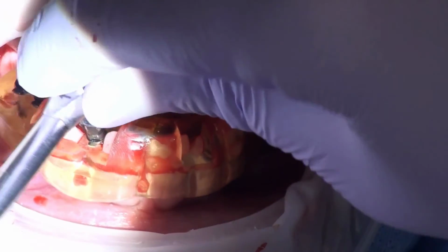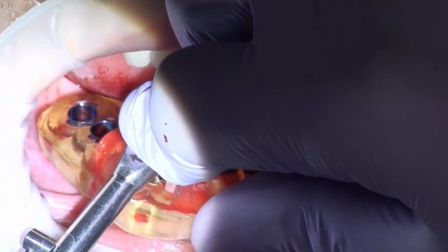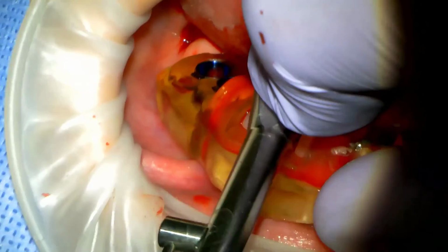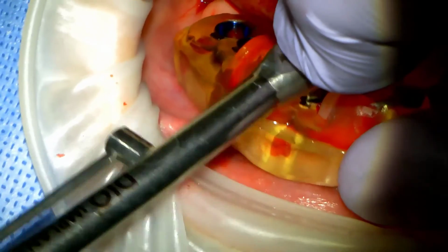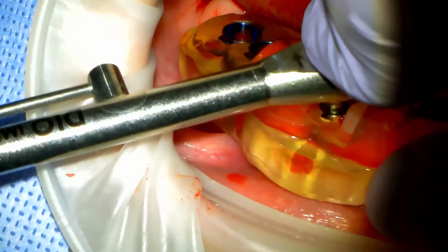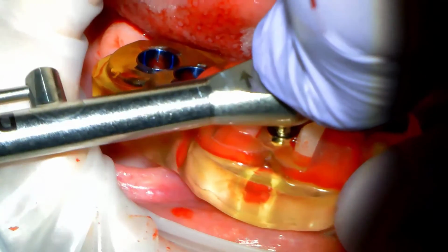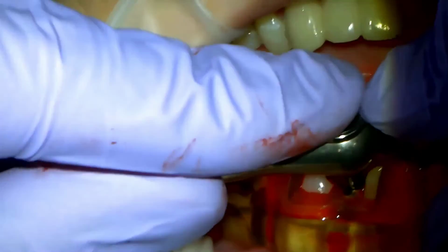I got this on backwards. So right there you see it's basically lined up, but that is not all the way to depth. So I'm going to take this to depth. It is not getting any tighter just yet. Almost to depth. Right there would work. I'm going to go a little more. I'm going to go one more past that, and right there. I'm going to go one more, right there. Let me point this out with an Explorer.